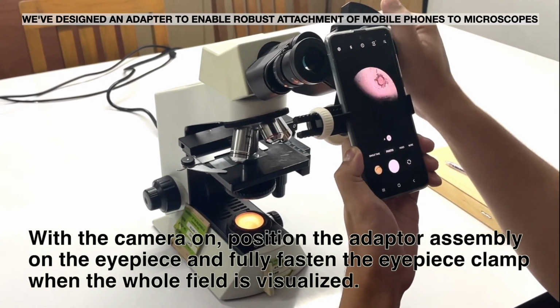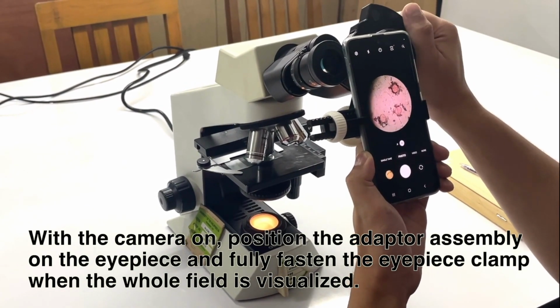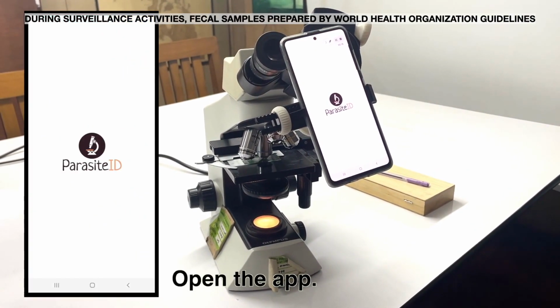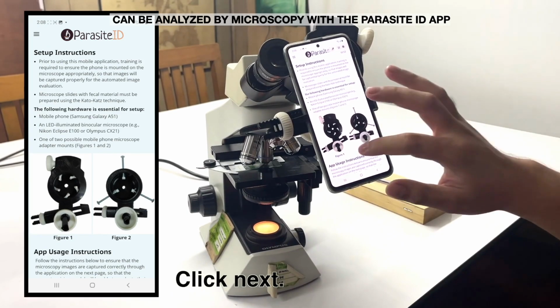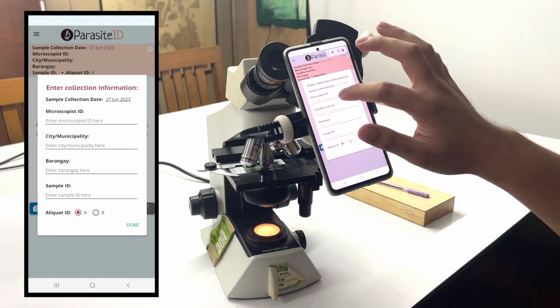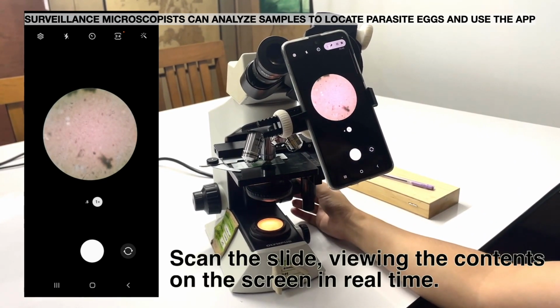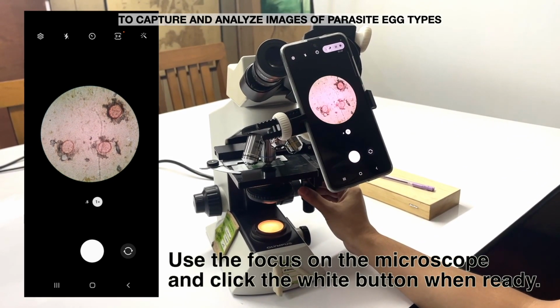We've designed an adapter to enable robust attachment of mobile phones to microscopes. During surveillance activities, fecal samples prepared by World Health Organization guidelines can be analyzed by microscopy with the Parasite ID app. Surveillance microscopists can analyze samples to locate parasite eggs and use the app to capture and analyze images of parasite egg types.